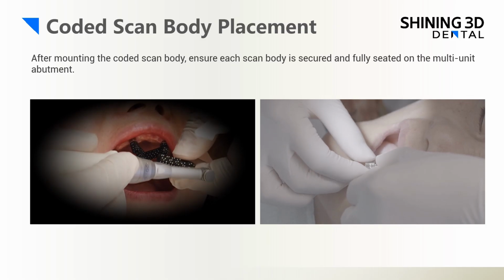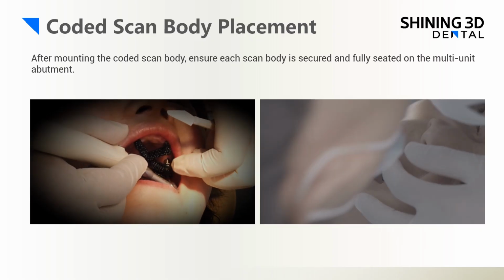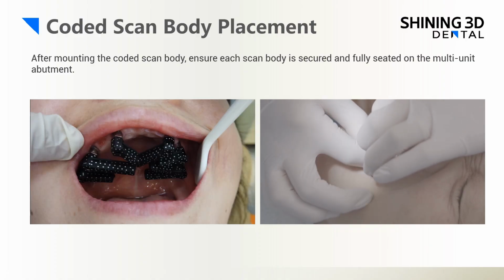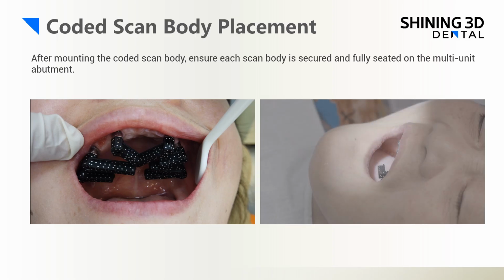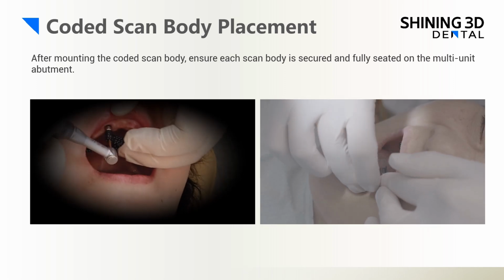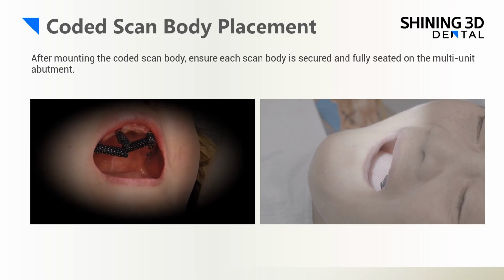After mounting the coded scan body, ensure each scan body is secured and fully seated on the multi-unit abutment. Visually verify that the interface of the coded scan body is fully seated on the multi-unit abutments and not stuck by the soft tissue in between the multi-unit abutment and the high accuracy coded scan body.